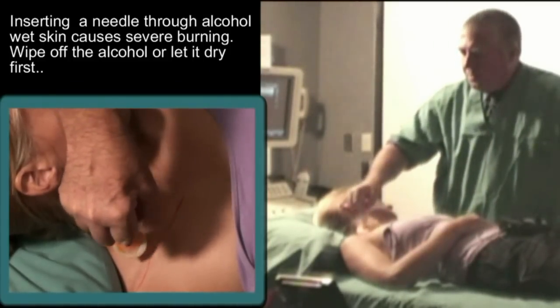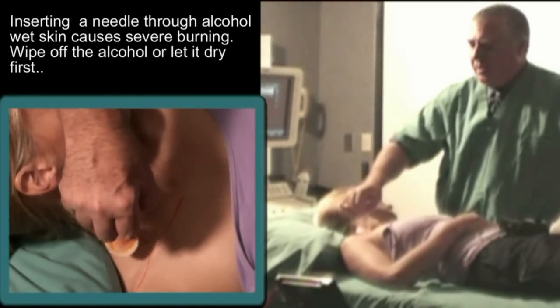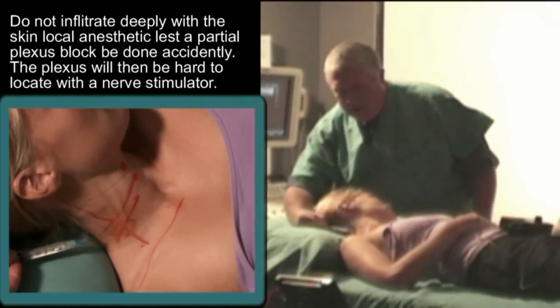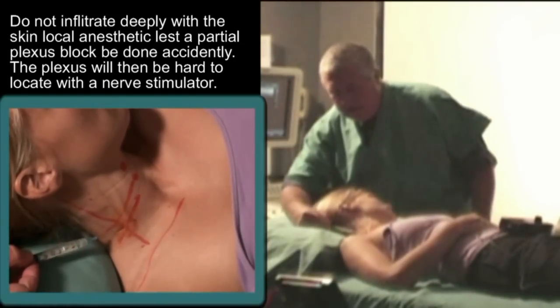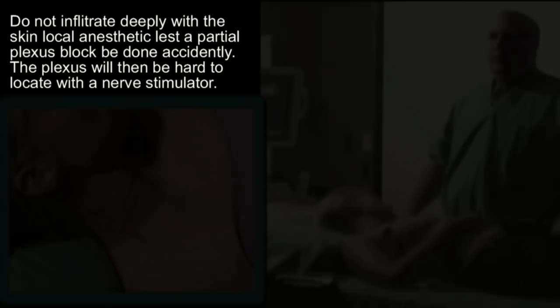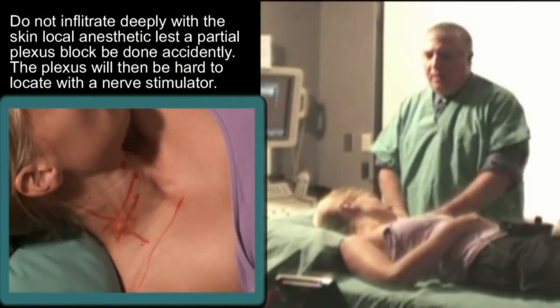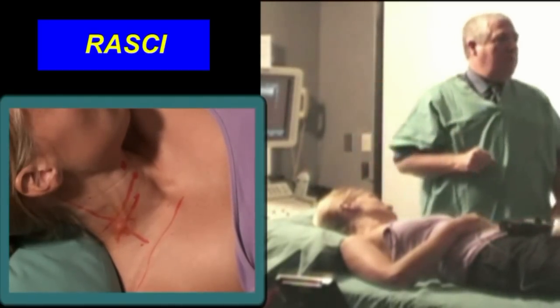Do not advance your needle through alcohol-wet flesh, because the alcohol burns. Here comes a little mosquito. You don't want to inject too deep. You don't want to block accidentally with the lidocaine, which will stop you identifying. Try to avoid a too intracutaneous injection — they actually burn more and hurt more.